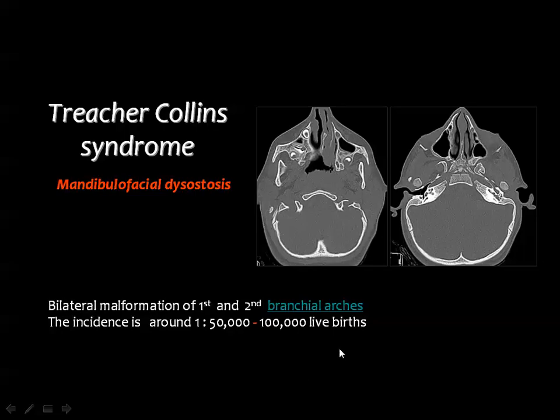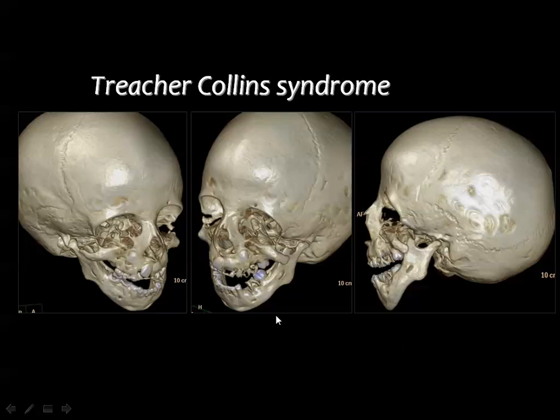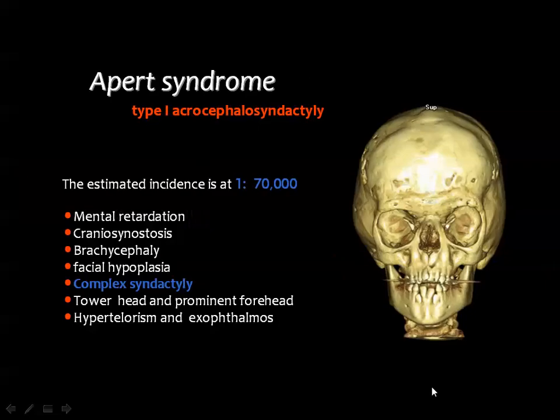Treacher Collins syndrome is a very rare anomaly that affects mainly the mandible and the zygomas as well as the zygomatic arches. A key diagnostic feature best appreciated on 3D CT is bowing of the lower border of the mandible. There may also be hypoplasia or absence of the zygomatic arch. Different 3D reconstructed skull projections show deficiency of the zygomatic arch bilaterally and hypoplasia of the mandible with concavity of its lower border.